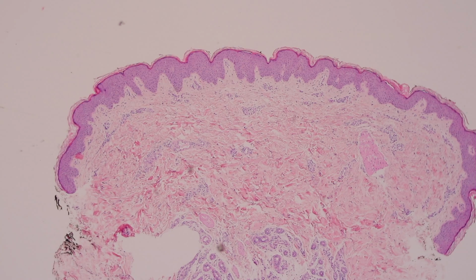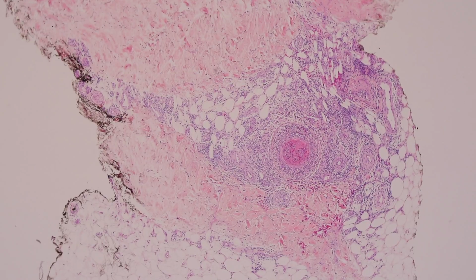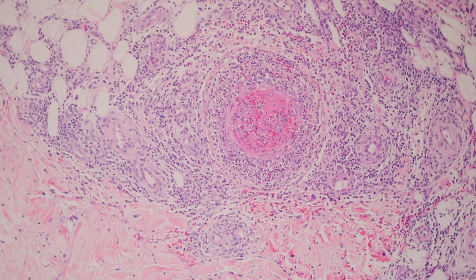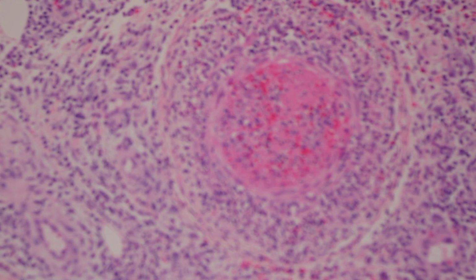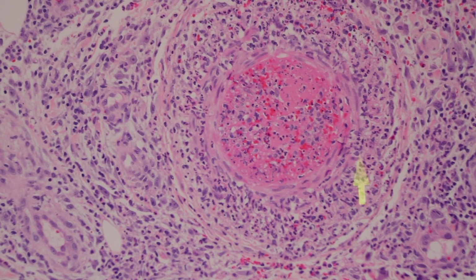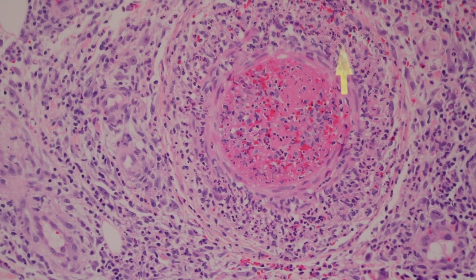And here's another one. Beautiful example. The upper portion of the dermis, the epidermis, looks basically normal. But when you get down here at the junction of the dermis and the subcutis, you see a medium-sized muscular vessel that's totally inflamed. So it's not quite as advanced as that last one I showed, which has destroyed the whole vessel. Here you can actually see very beautifully the multiple layers of muscle in the media, the medial layer of the vessel wall, and you can see all these neutrophils that are just destroying the muscular wall.